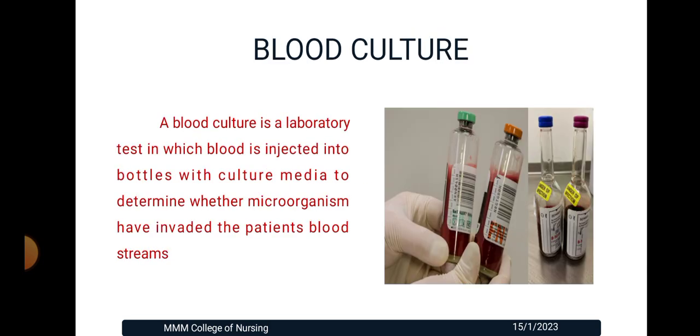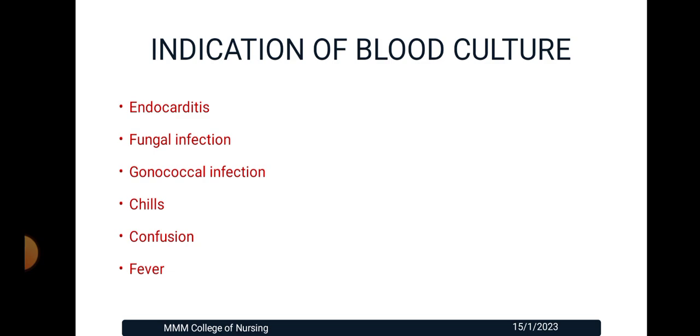Blood culture is a laboratory test in which blood is injected into bottles with culture media to determine whether microorganisms have invaded the patient's bloodstream. Indications of blood culture: endocarditis, fungal infection, gonococcal infection, chills, confusion, and fever.